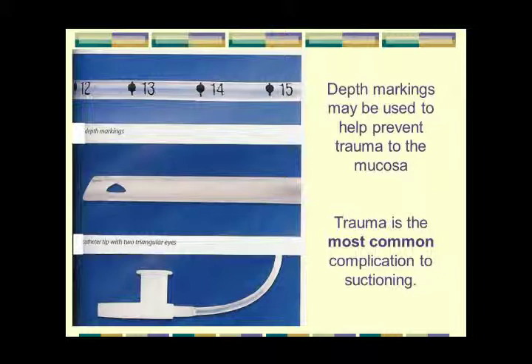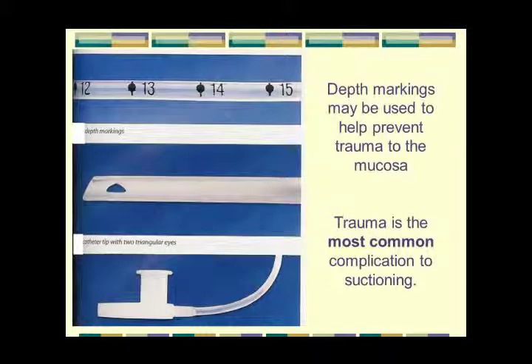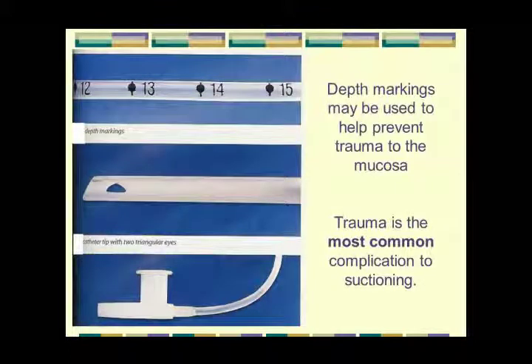On some tubes, to be able to know how deep you are, there are markings on it. Well, we talked about the various types that also had a little Murphy eye on the side. And there's our thumb port that we put our thumb over.